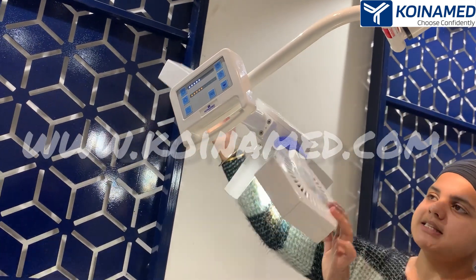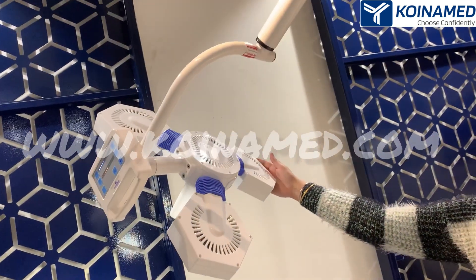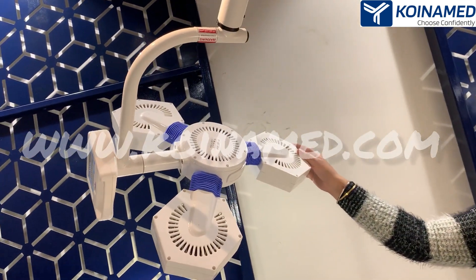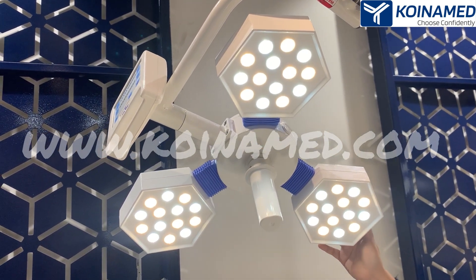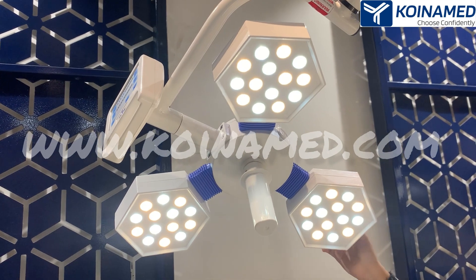On the back side you can see we have provided European design for the heat ventilation. The total number of LEDs are 42 and the intensity of this dome is 90,000.